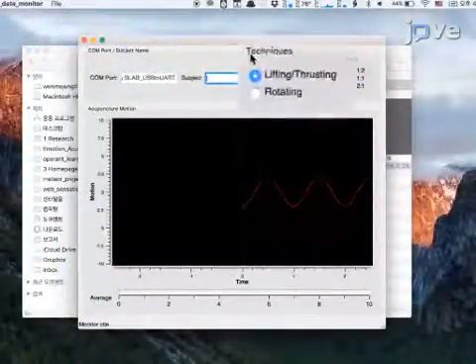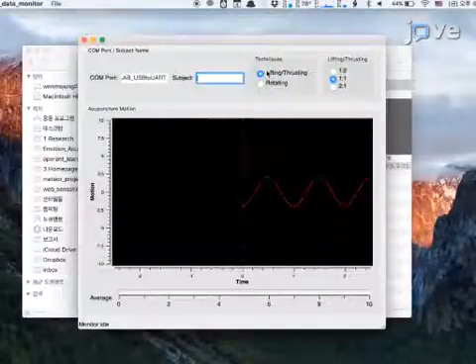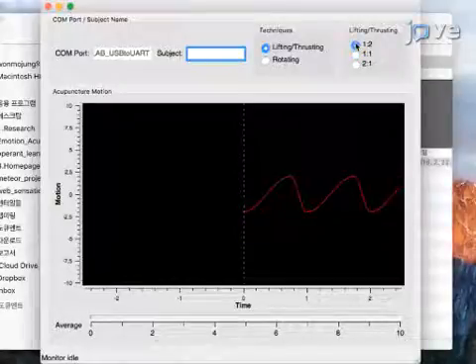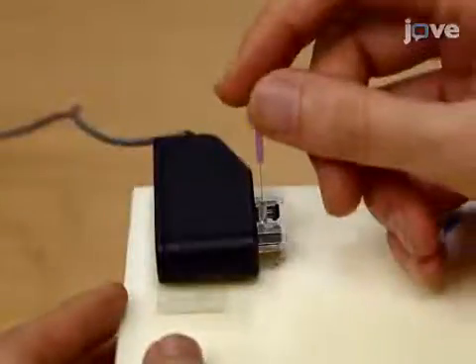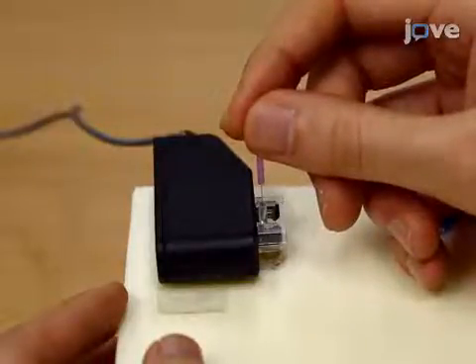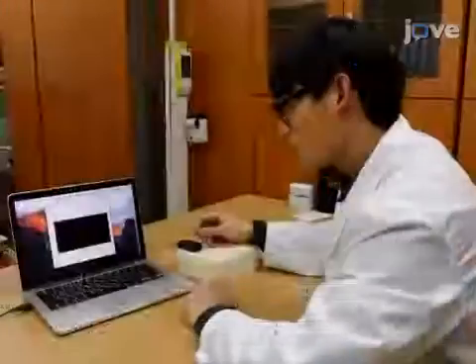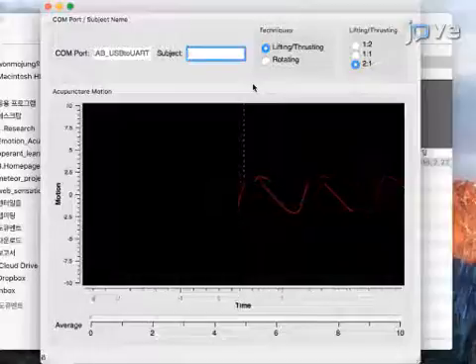Before starting the manipulation, choose from lifting thrusting or the rotating manipulation technique by pressing one of the two radio buttons displayed on the graphic user interface. Then, for the intended movement for practice, choose between a pattern with a 1-to-1 ratio, a 1-to-2 ratio, or a 2-to-1 ratio sine graph. Next, using a two-axis actuator, calibrate the motion sensor by positioning the acupuncture needle with the participant's finger and choose calibrate on the screen. Through the calibration, the two-axis actuator will recognize and adjust the current position as a zero value in depth.